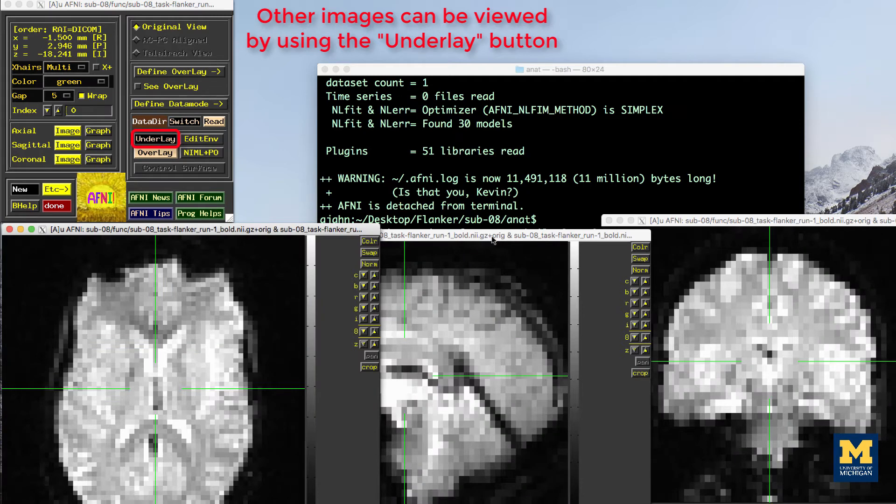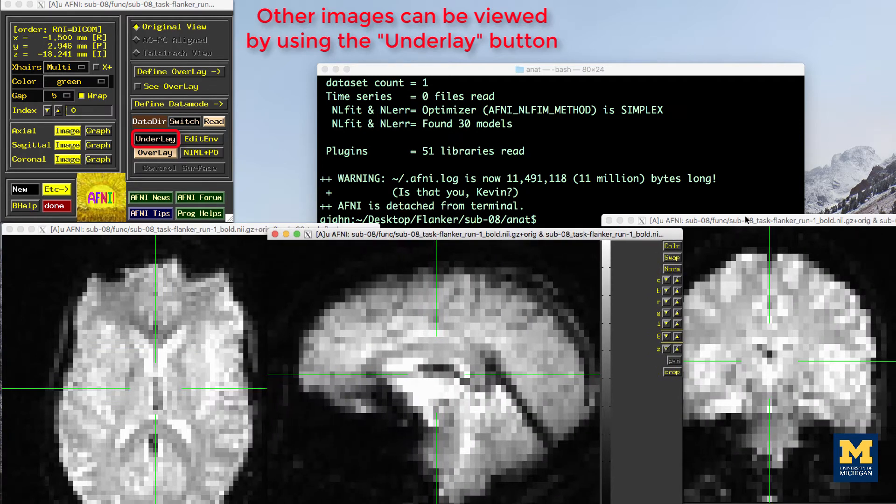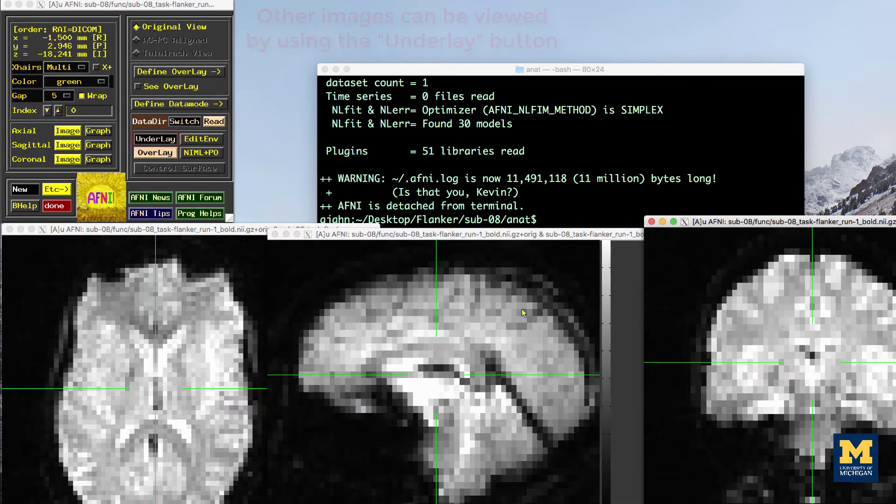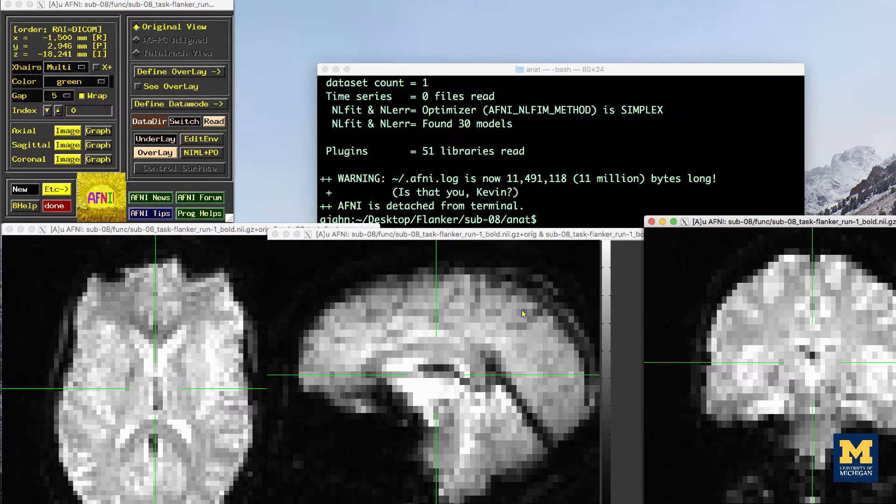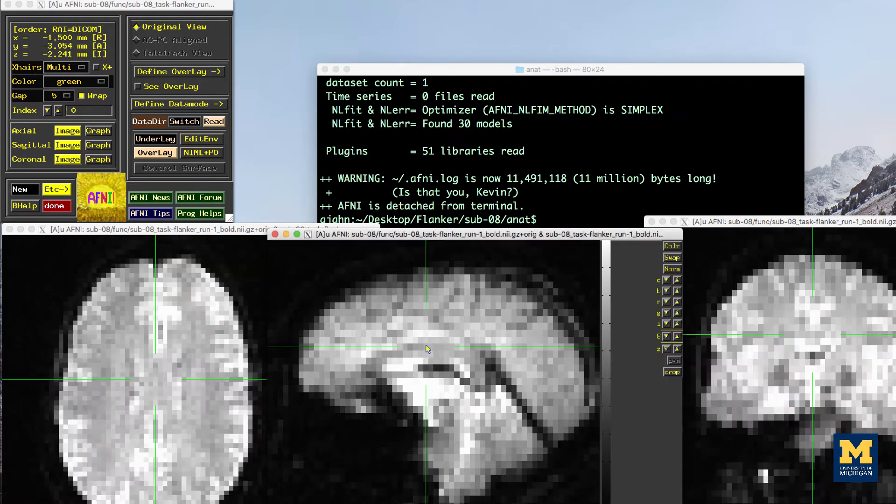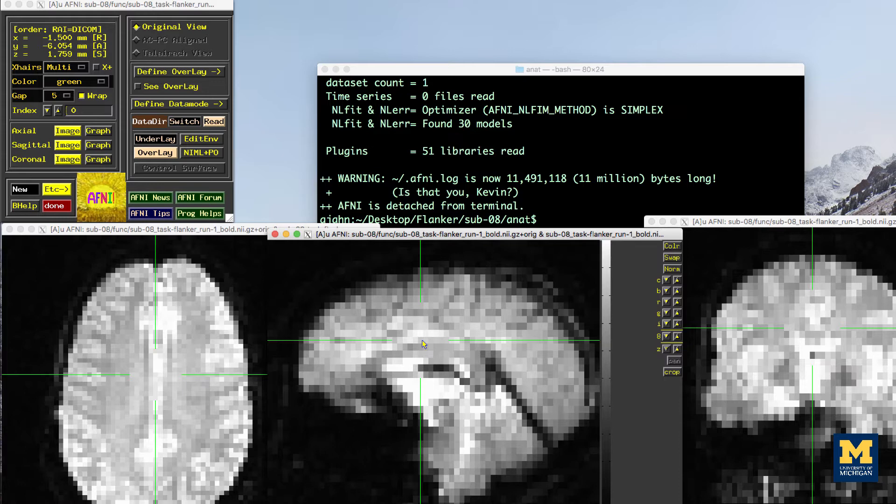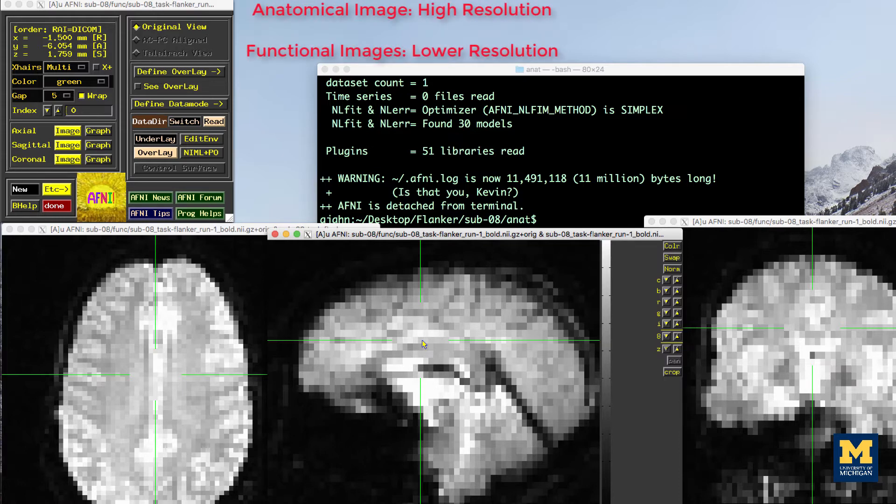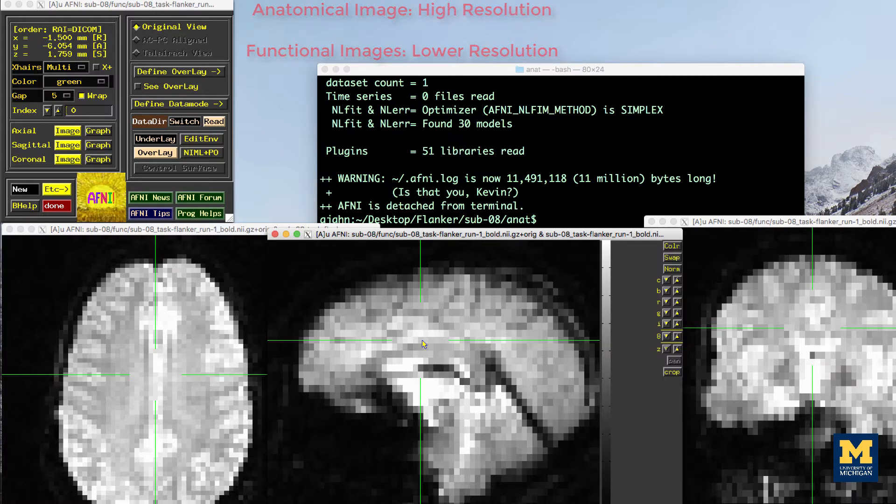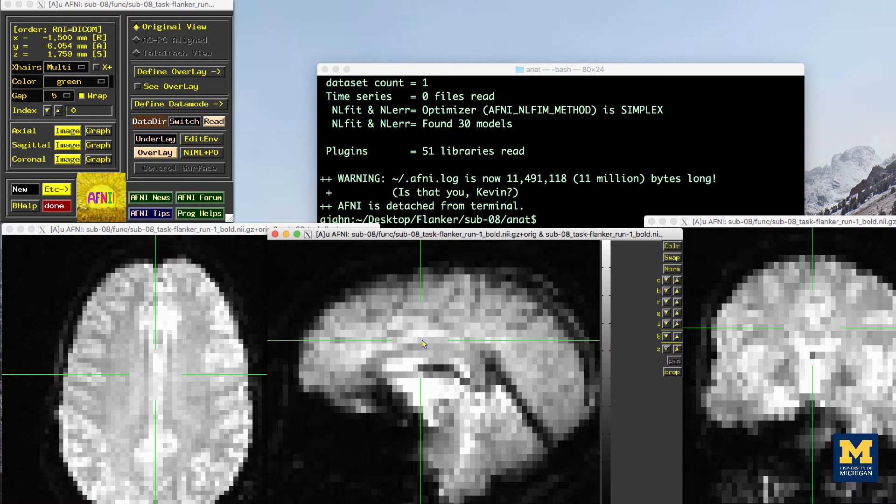This new image also looks like a brain, but it's not as clearly defined as the anatomical image. This is because the resolution is lower. It's typical for a study to collect a high-resolution T1-weighted or anatomical image and lower-resolution functional images, which are lower resolution in part because they're collected at a very fast rate. One of the trade-offs in imaging research is between spatial resolution and temporal resolution. Images collected at higher temporal resolution will have lower spatial resolution and vice versa.